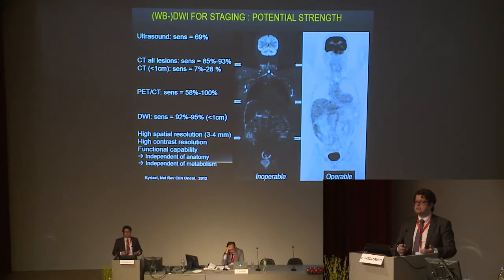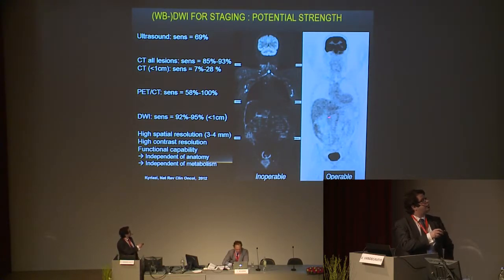This is actually the same patient. You can see it seems completely negative on the PET, and look at the diffusion. Everything that is white here in the peritoneum concerns a confluent tumor around the liver, but also, very important for the surgeon, around the portal vein.